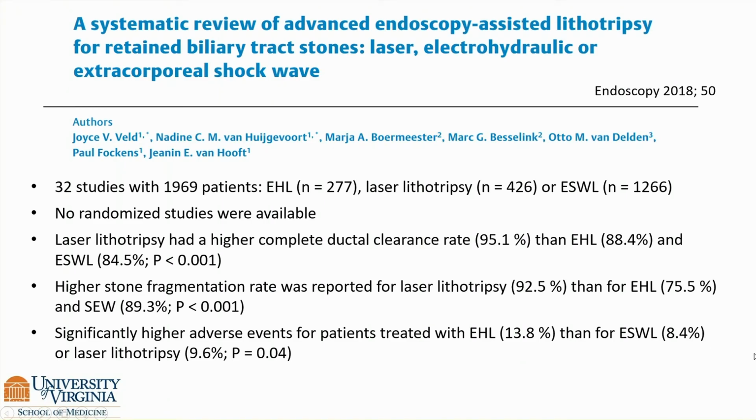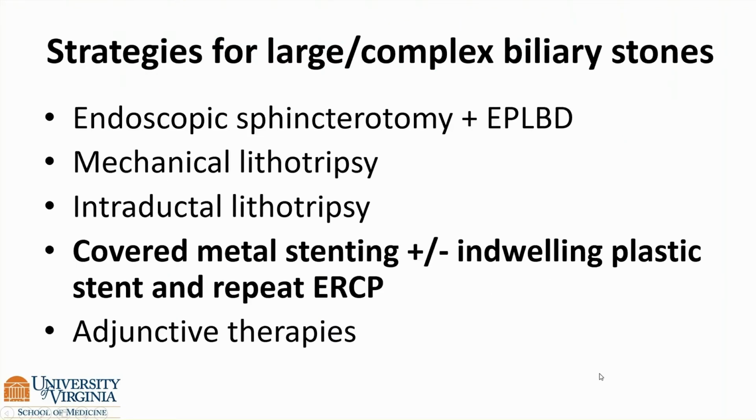So this is just one study, but it does compare in a systematic fashion almost 2,000 patients who underwent EHL, laser, or external shockwave for difficult to clear bile duct stones. And in this particular study, which actually did not include any randomized data, laser lithotripsy had a higher complete ductal clearance rate, higher stone fragmentation rate, as well as fewer adverse events. But really, I think the ASGE and ESGE guidelines support any one of these modalities in a comparative way.